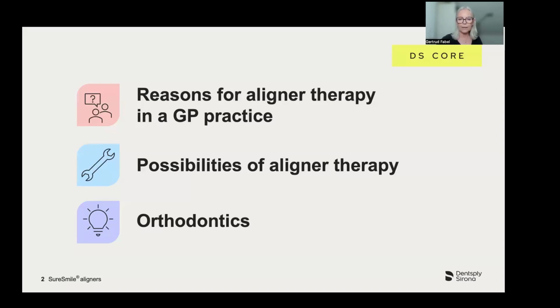After completing the aligner treatment, retaining the teeth is crucial. Whether patients receive fixed or loose retainers, they must be checked at short intervals during the first 6 months. While biomimetic digital dentistry copies nature in the best way in prosthetics and restorative therapy, we use digital tools in orthodontics to improve nature. Aligner treatments often simplify steps or reduce therapies in all-over plans.